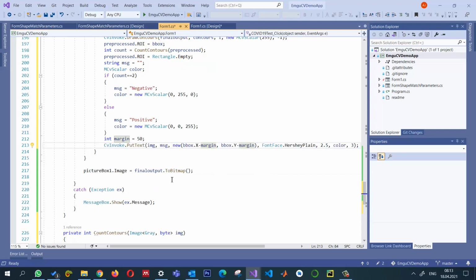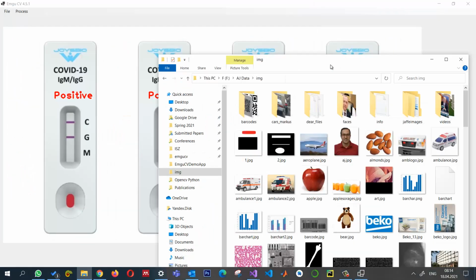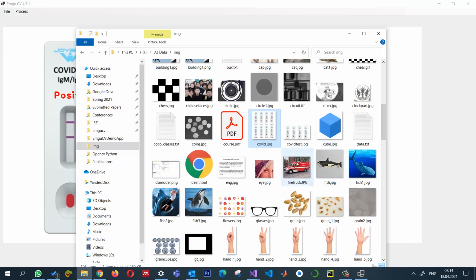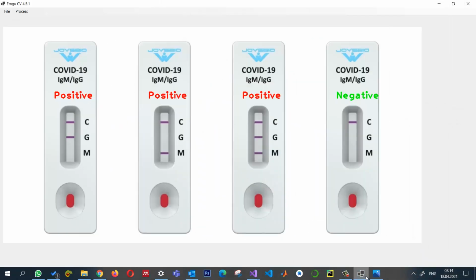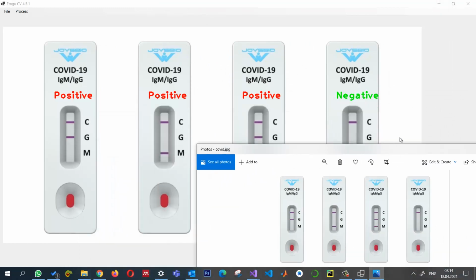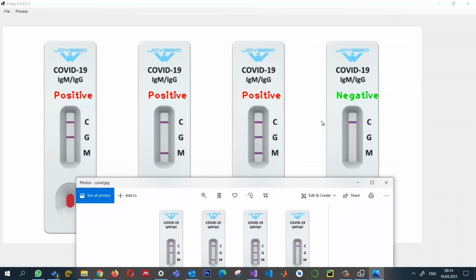Okay, and that's it. So we just put an image, and we set the result, and then we can display it also, img.ToBitmap, and let us run it, and let's see if we can select it. And for this one, when I say COVID-19, okay, so this is what exactly we were looking for. And where was that COVID one? Is this in line with this one or not? So we have these, sorry, this is the positive, positive, positive, and the one is negative. This is exactly what we did for the COVID-19 test.